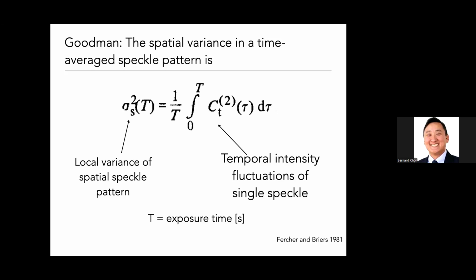But it's the same thing as with the image showing the train moving. You could look at a small area of that image, and if I showed you two areas of that image, one on the person and one on the train, and I asked which was moving faster, you would probably give me the right answer. So qualitatively, there is this inference you can get just by looking at a small area of an image. And in our case, we're talking about the visibility of the speckles.